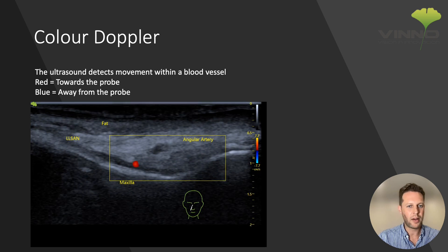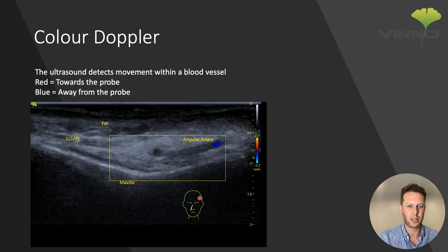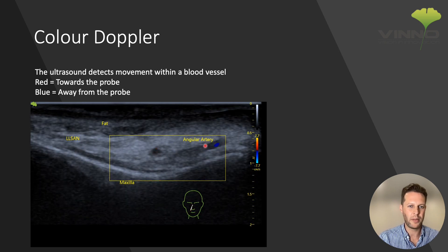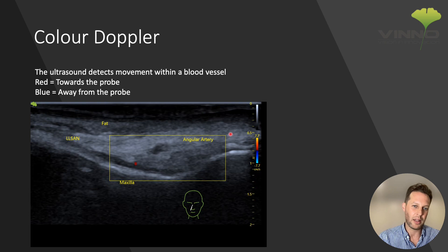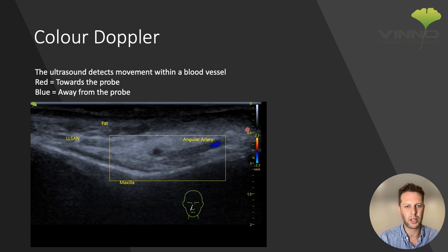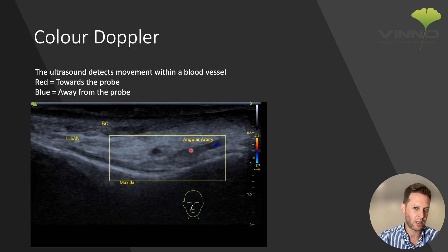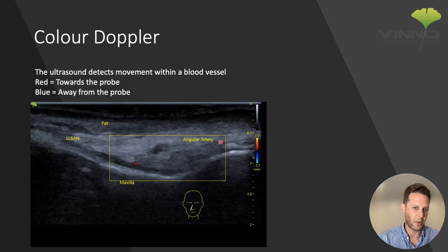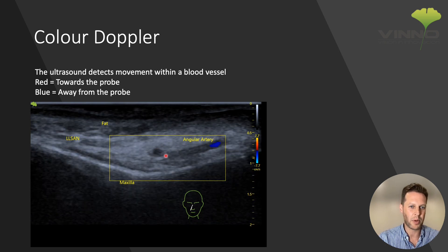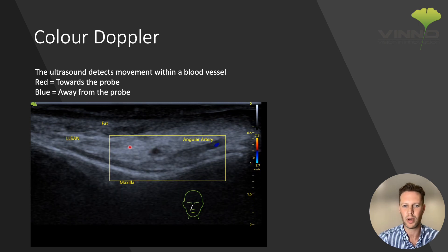In this image in the mid-face region, just lateral to the nose, this is the angular artery. Even though we can see some of it is red and some of it is blue, it is actually the same vessel. The angular artery is going down in one direction, so that part is blue because it's moving away from the probe, and the other part is red because it's coming back up towards the probe. That's the reason for the red and the blue.